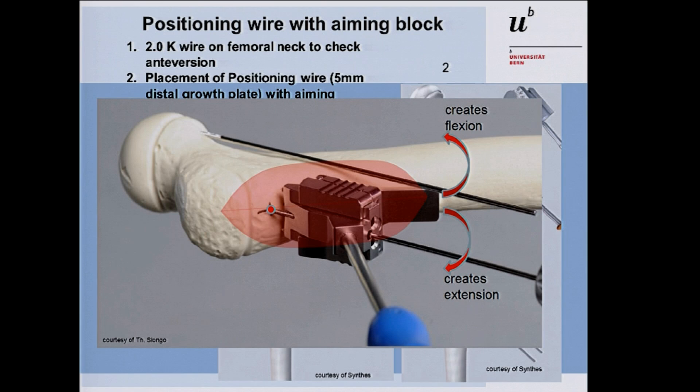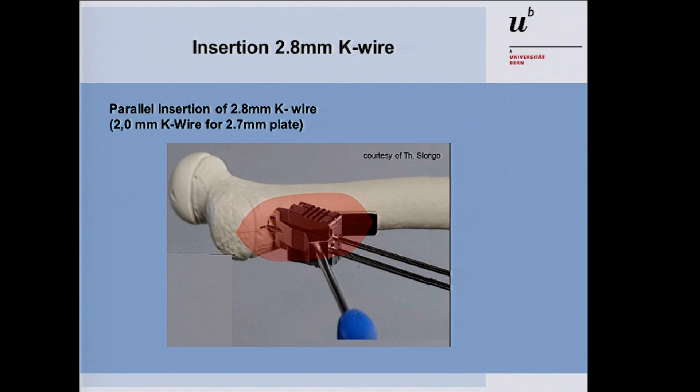If you want to give extension or flexion correction, you can rotate the wing of the aiming block anteriorly or posteriorly to create extension or flexion as additional correction in the proximal femoral osteotomy. With the guide wire in place, drill the 2.8 millimeter K-wires into the femoral neck in parallel fashion. Make sure the aiming block's two spikes are in contact with the bone so the 2.8 wires are truly parallel to the 2.0 guide wire. Check under image intensifier — the wires approach from posterior to anterior.